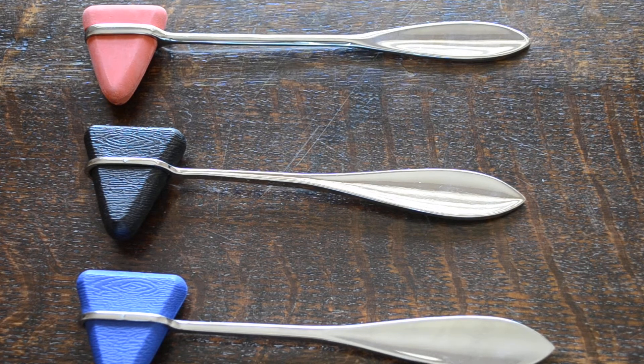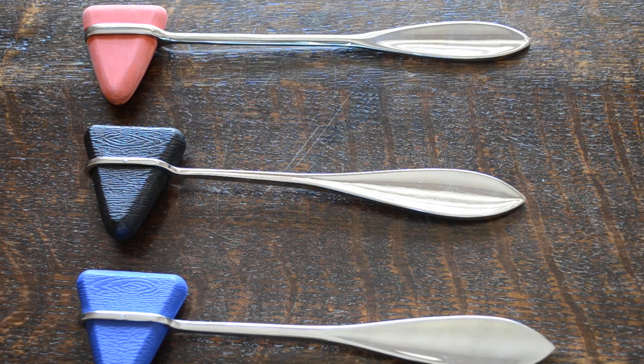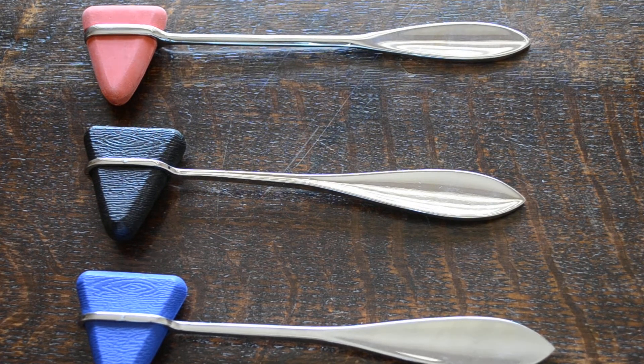Welcome to this video presentation. We're going to demonstrate the three different options available in the Taylor's reflex hammer available from Valumed.